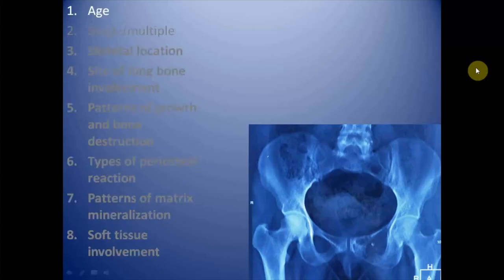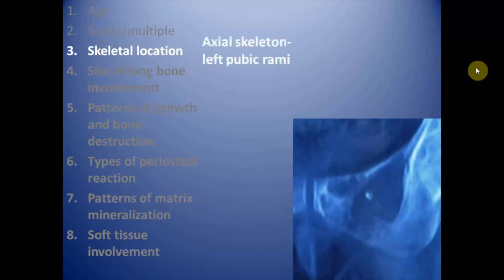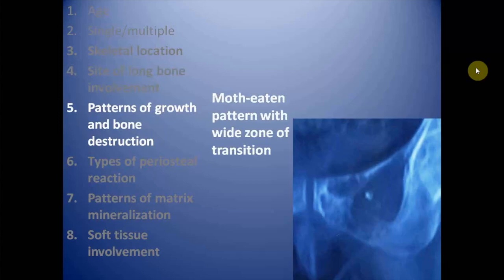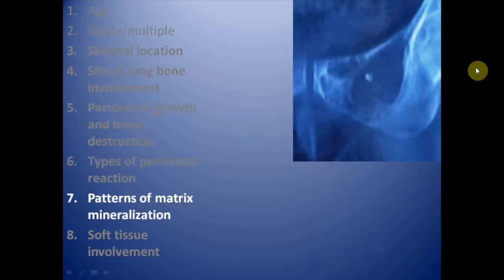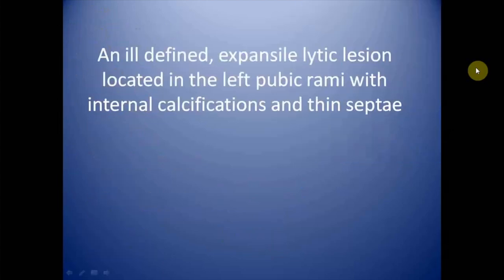Age of the patient is 45 years — a middle-aged female. The lesion is single. The skeletal location is the axial skeleton, involving the ischiopubic rami, so site of long bone involvement is not applicable. The pattern of growth shows a moth-eaten pattern of bone destruction with a wide zone of transition. The periosteal reaction is aggressive. There is a small focus of calcification with internal septations and definite soft tissue involvement. This is an ill-defined expansile lytic lesion located in the left pubic rami with internal calcifications.